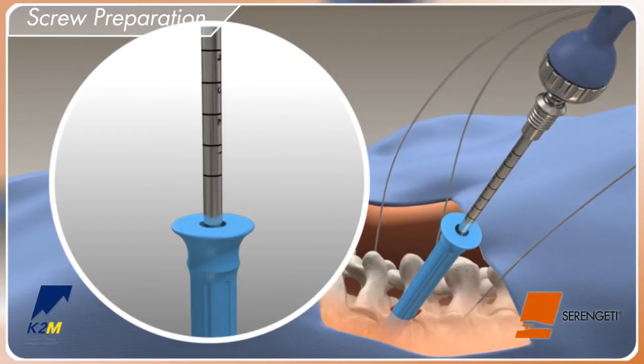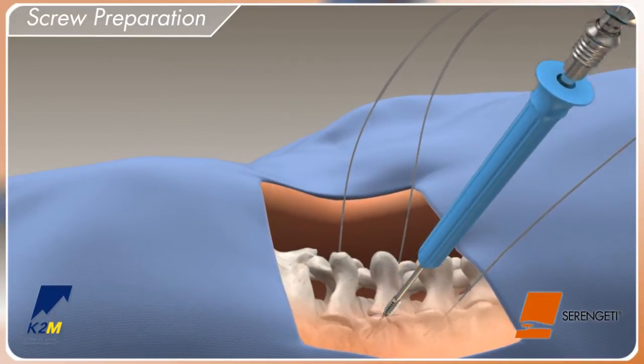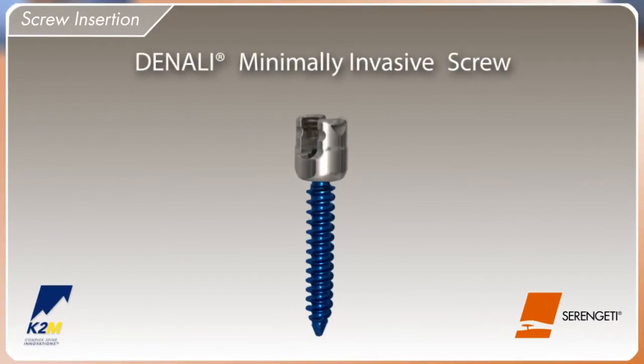After the pedicle has been prepared, fully back out the tap. Pull up on the outer dilator and remove the all-tap and outer dilator together. Select the proper screw implant and load onto the Serengeti screw inserter.